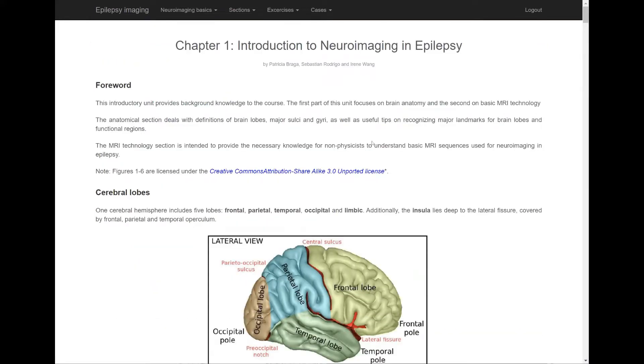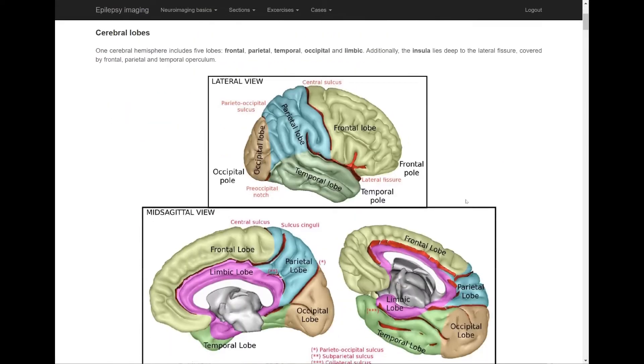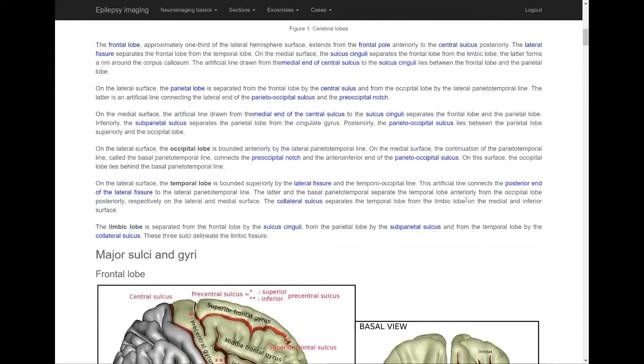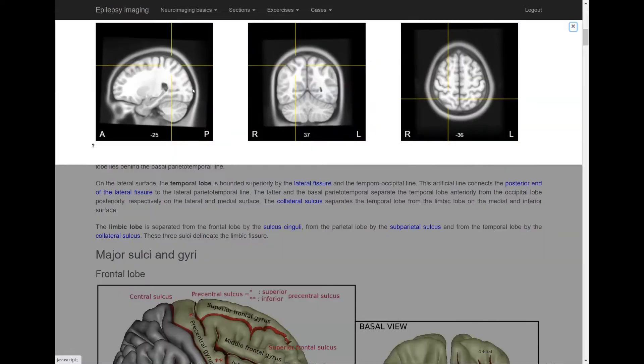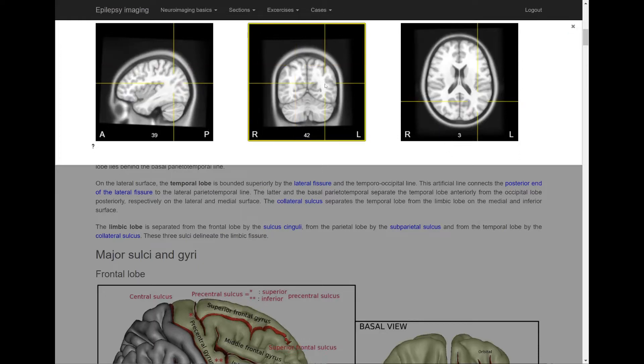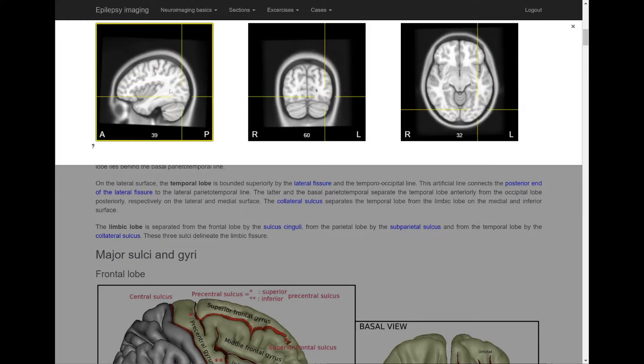Here is the chapter on anatomical landmarks. You'll notice that there are links embedded into the text. When you click on them, a separate panel opens that shows the respective landmark on a template MRI. This is however not just a static image but a fully functional MRI viewer.